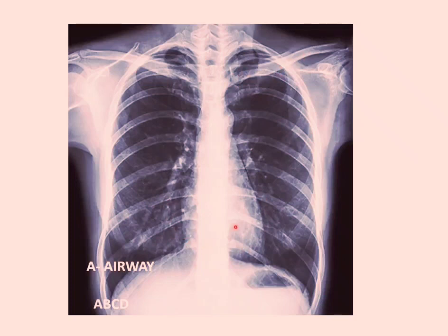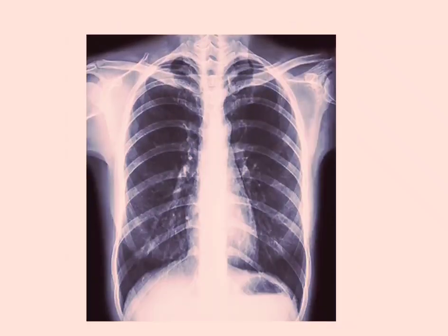Okay, some soft tissue. So this is the color effect depending on the absorption of the X-ray beam. Now the other soft tissues, like muscle and fat, appear as a gray structure. It is not as white as bone, not as dark as air. So this is the first structure seen in the X-ray chest, the trachea, a midline dark shadow in the upper part of the mediastinum. The second structure seen, you can remember from B.